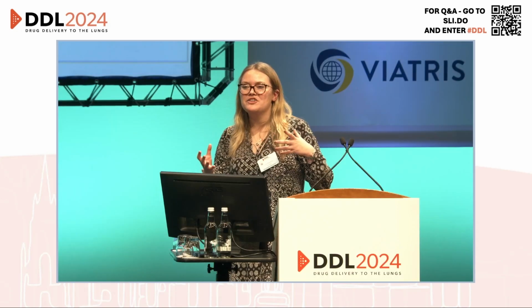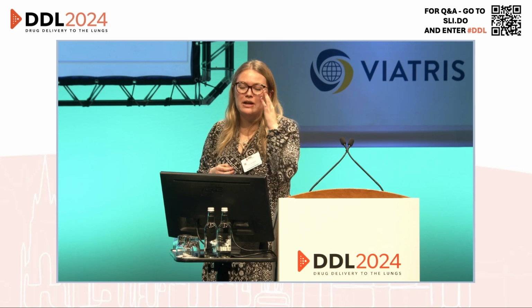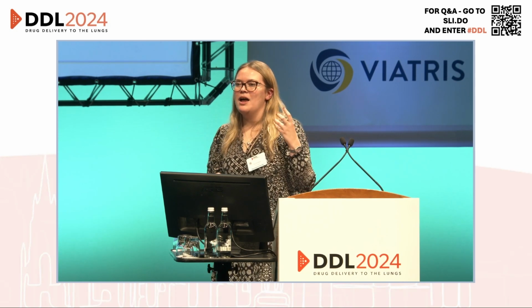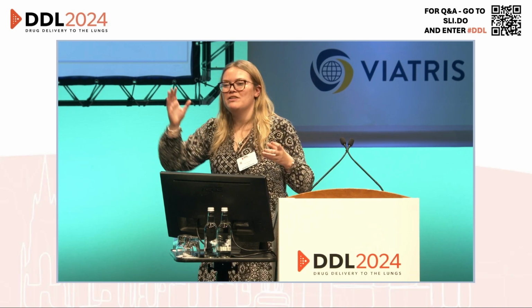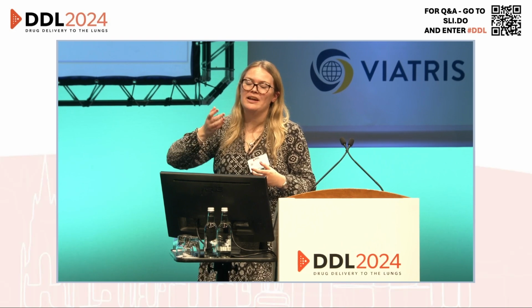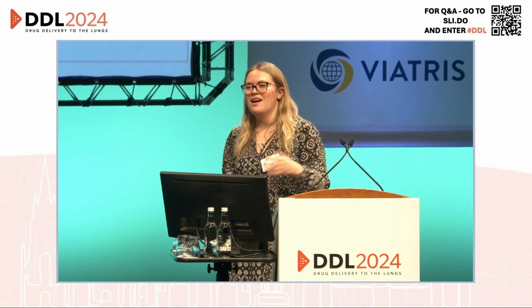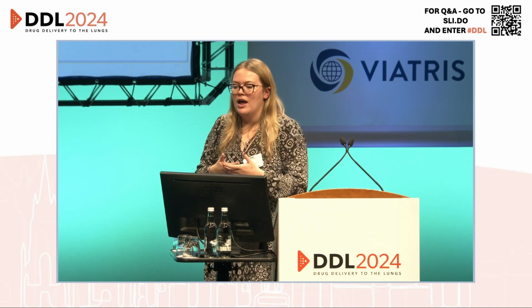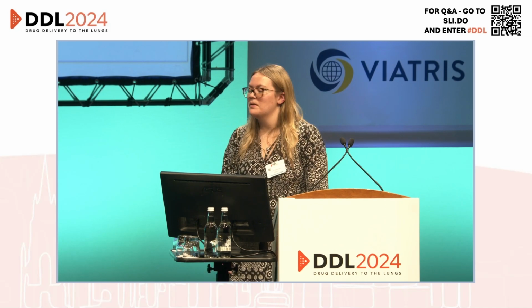Yeah, nebulization would have been a great technique because what's done at the moment, especially at Aptar, is they nebulize water. So it'd be great to have a mucus to nebulize to compare the difference. When I tried to nebulize, because of the viscosity of the mucus simulant, even if I cooled it right down to make it a liquid, it couldn't nebulize. The surface tension and the viscosity was too high. I don't know if there's ways of improving the nebulizer to see if we can nebulize viscous solutions. That might be an option. But unfortunately, I didn't have any data to go with the nebulized technique that I did.